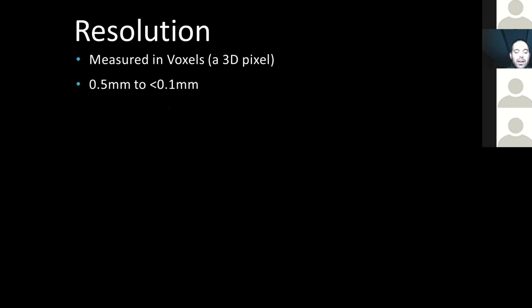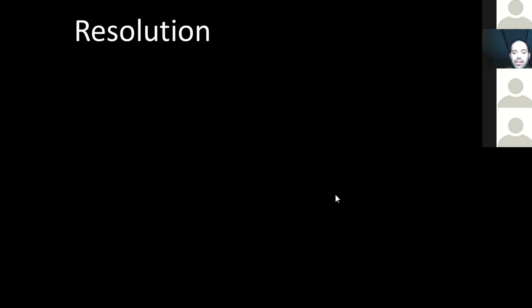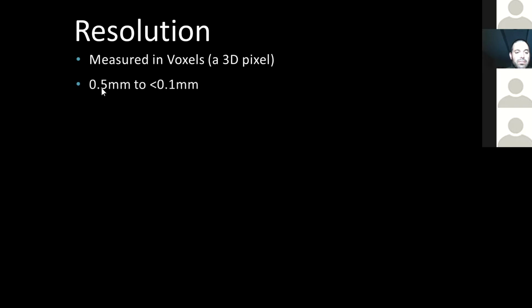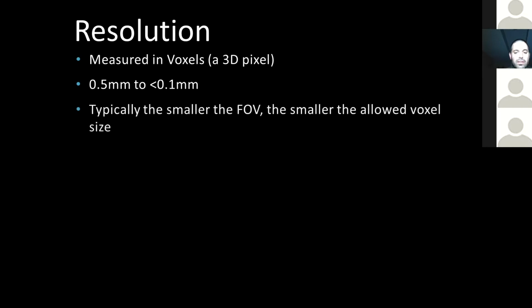fractures. You still won't see them, but we can spend a whole other course talking about fracture imaging. But if you were to try and look for those features on a larger scan, you might only get to the 0.2 or 0.15 voxel size at best and miss some of that detail. We'll come and talk about that small high-res scan in a little bit.